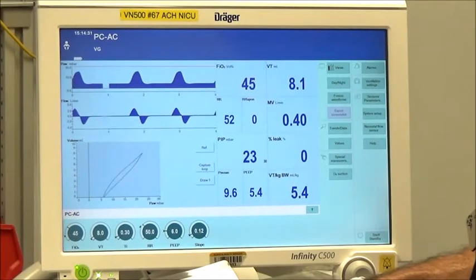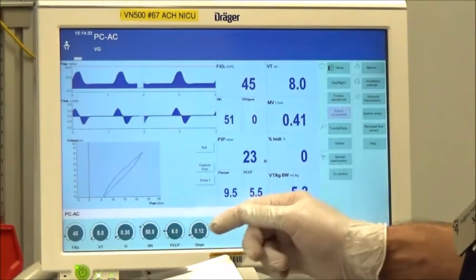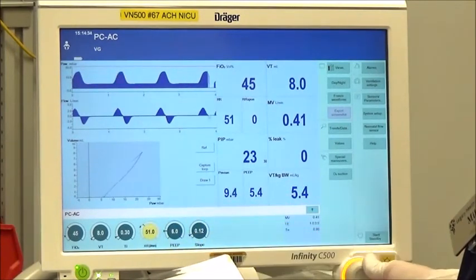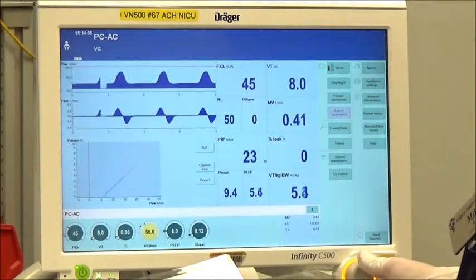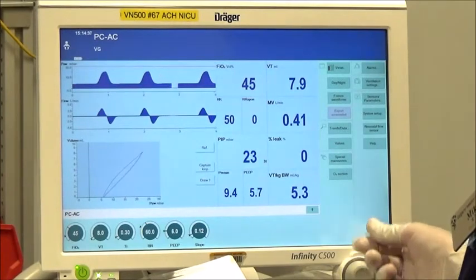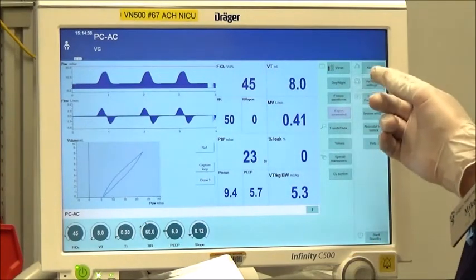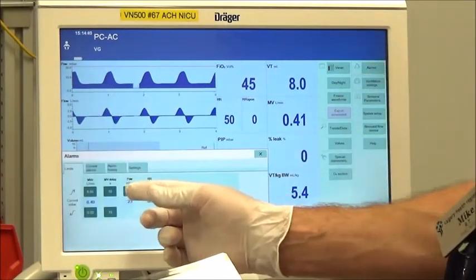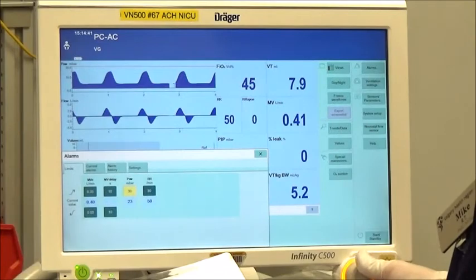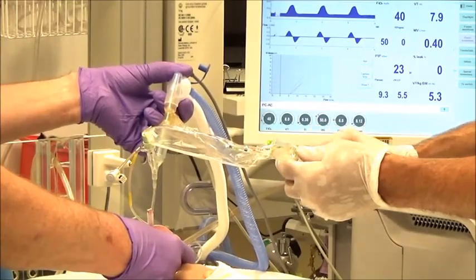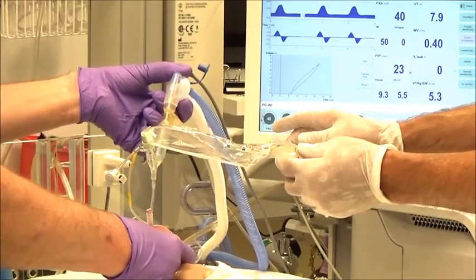While on volume target mode, increase the ventilator high pressure alarm to 35 cm of water and ventilator frequency to 60 breaths per minute for surfactant administration.